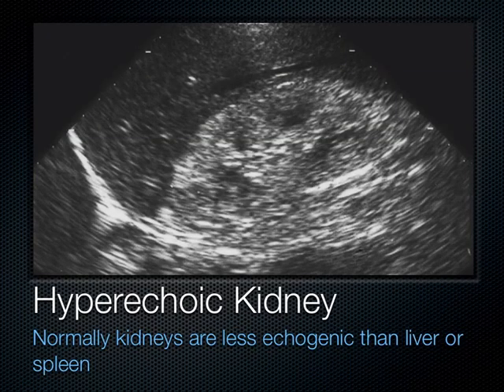Now moving on to the abdomen, there's lots of ways we can diagnose infection in the abdomen. I'm going to start here with the genitourinary system, and we're going to talk about the kidney. Now, pyelonephritis, this is the kidney here. You're used to seeing it much less echogenic, but this is what a kidney looks like when it's infected or has pyelonephritis, which is normally a very clinical diagnosis.